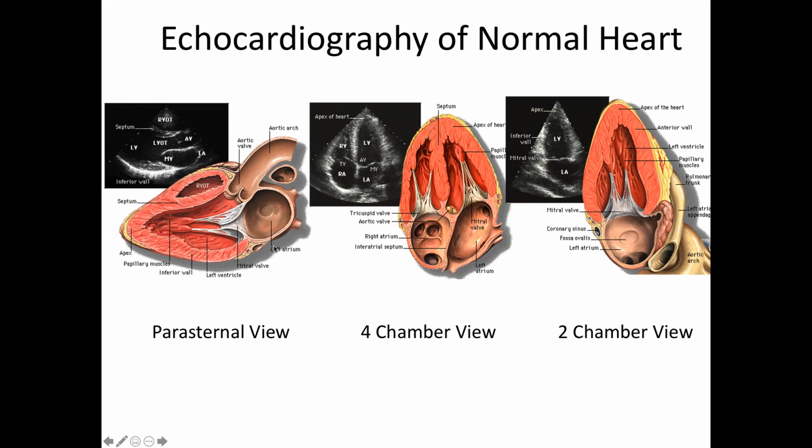Now, this is just a cardiac example, but in OBGYN, when you're looking at staging, where a fetus is in development, a lot of that is the skill of the technician waiting for the right moment and getting the right plane through the fetus when the fetus is moving around and sucking their thumb and doing this and that. Sometimes they can coax the fetus to move in a particular direction and get the right plane. In cardiac, the heart's not moving around, other than beating, you hope.